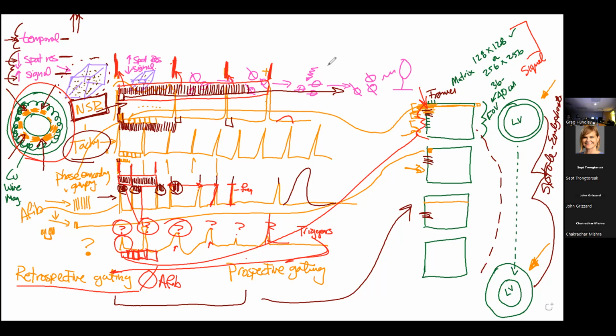There are a lot of tricks we use to do that. We don't have a lot of time to describe all those tricks. It has to do with the antennas, how we put images together. But the key I want you to remember: why wouldn't we do real-time or snapshot imaging all the time? Well, because of this. Instead of these beautiful acquisitions of lines and all the averaging, we're just going to go blam, blam, blam. Your spatial resolution of these images, how many lines, your matrix, is going to be low.